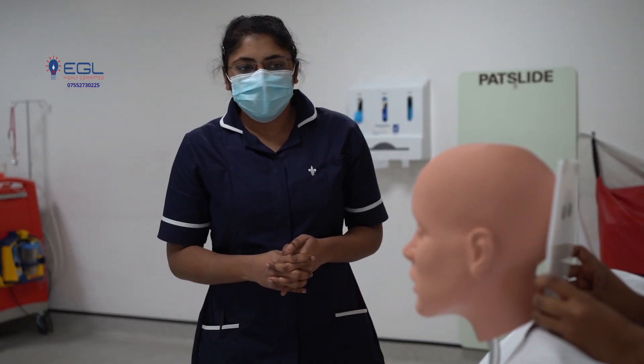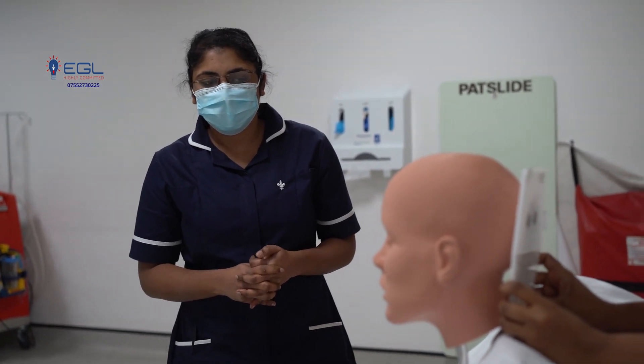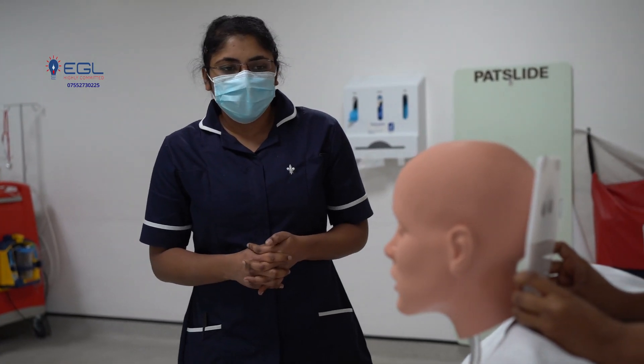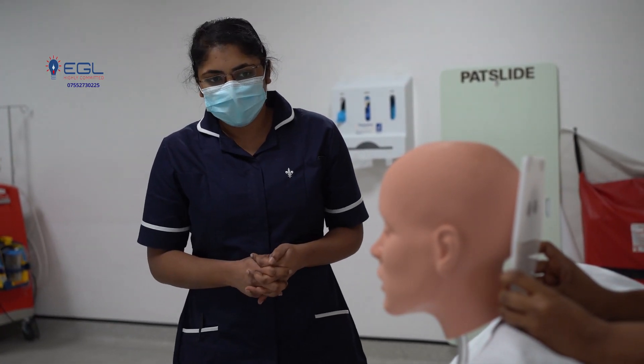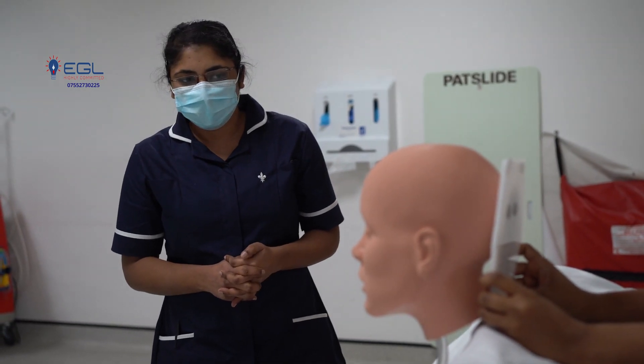As per doctor's advice, I am going to insert the NG tube. Is that alright? Yes. Do you know the purpose of the NG tube? No. It is to give short-term nutrition, usually for 2 to 4 weeks. Okay. Is that clear? Yeah.